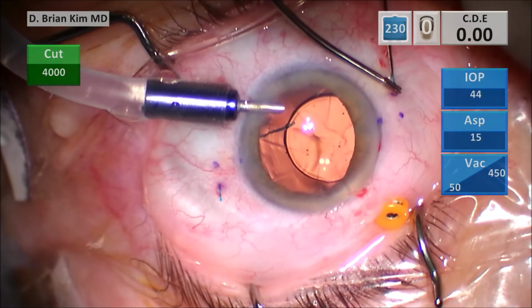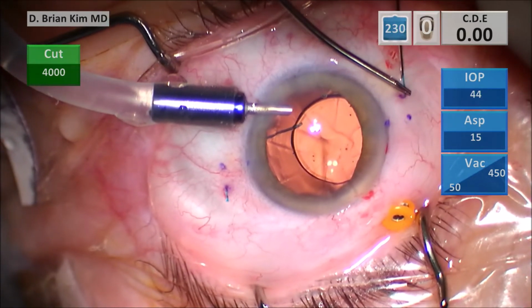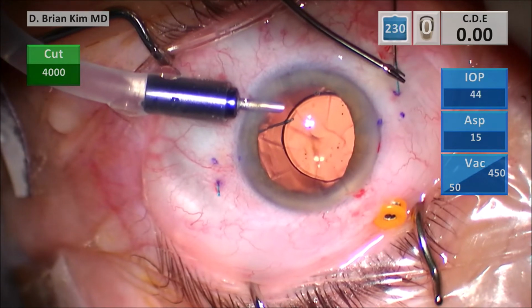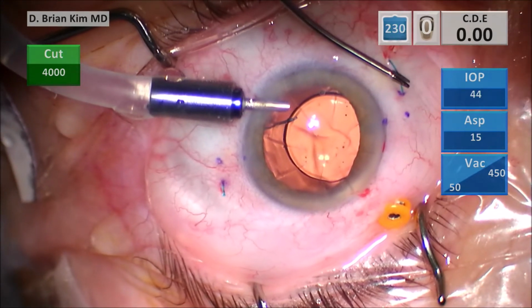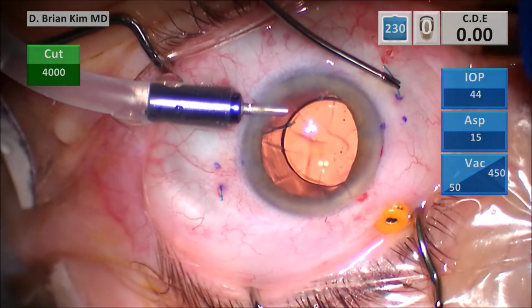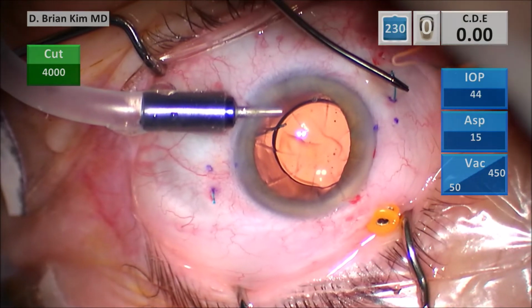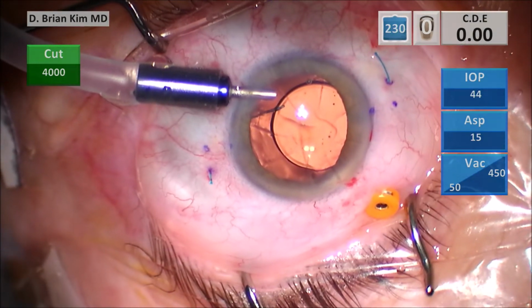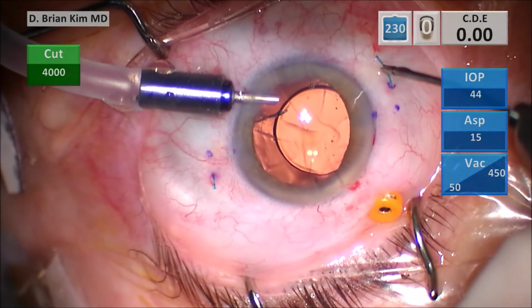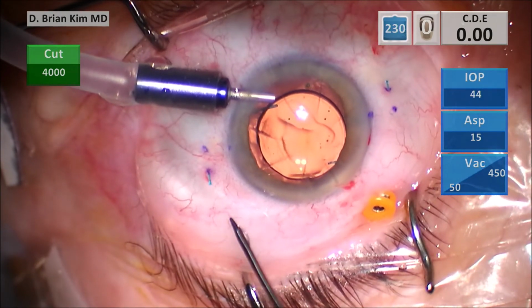Cauterize the tip. You get a tiny little bulb. Switch hands and do the same thing on the other side. Micrograspers on the left hand now, using your right hand to pull the needle out away from you, making sure you grab the haptic as the needle is withdrawn, and making sure that not too much of the haptic comes out as you're pulling the needle out. You just want to make sure it doesn't cause too much traction on the other side. And then you're going to cauterize the tip, get a small bulb again.